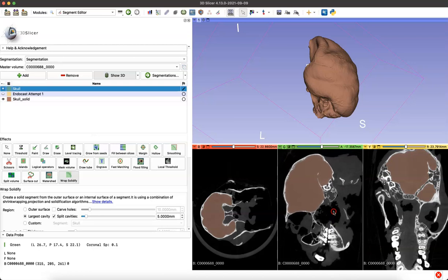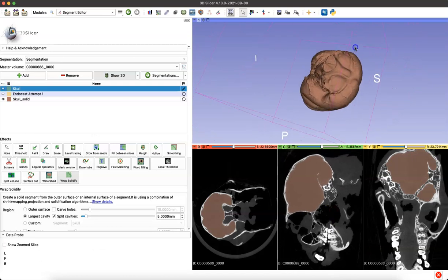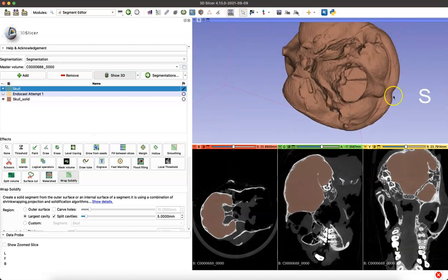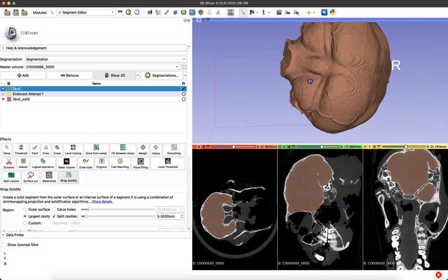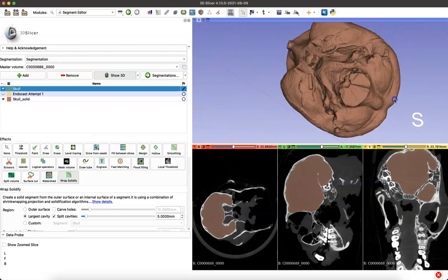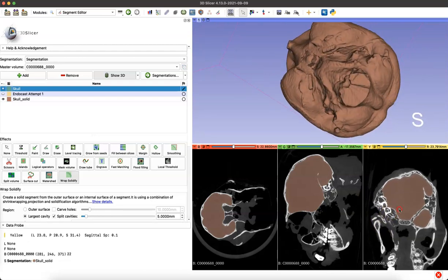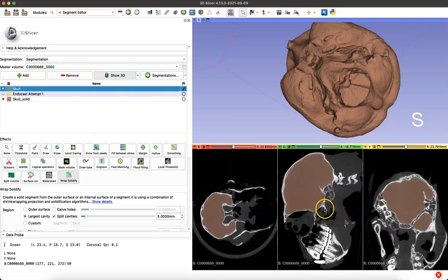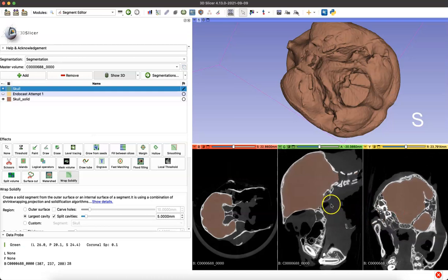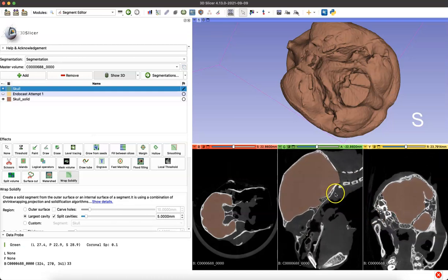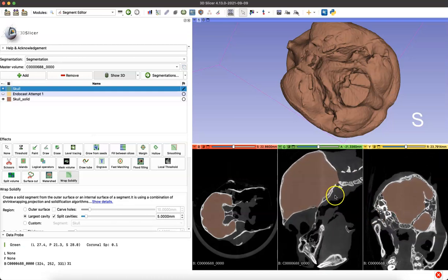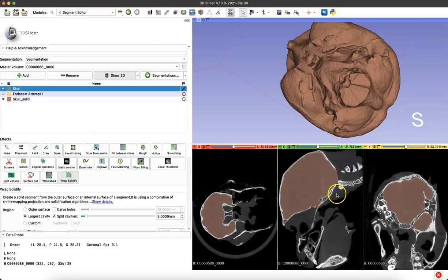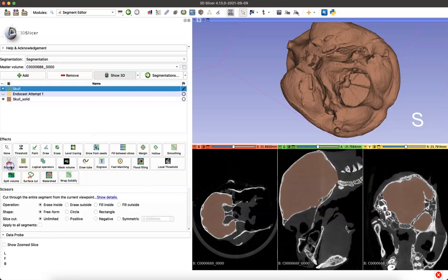You might have to go through and clean up the model a little bit. For instance, with the foramen magnum you can see it's a little irregular here because the program is just automatically cutting it off where it sees best. But depending on your protocol for your lab, you can go through to the widest opening point of the foramen magnum.